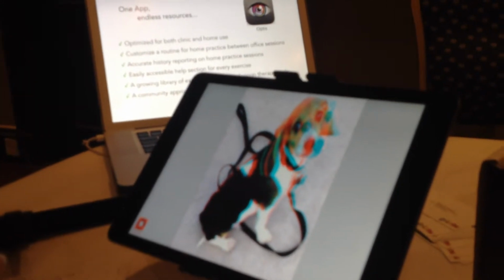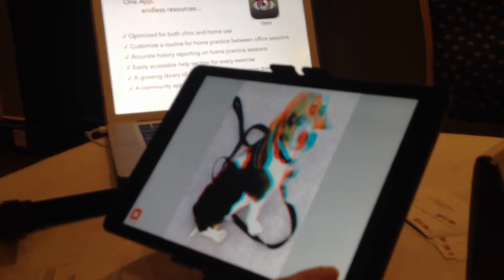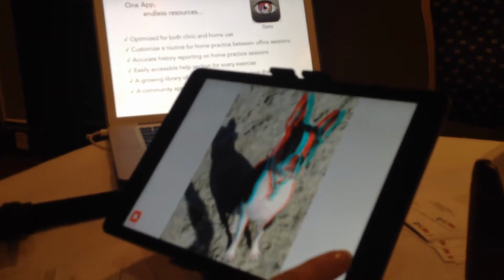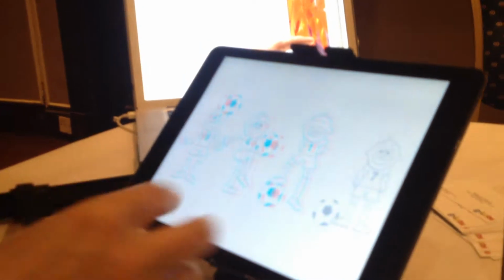And I think you told me that if there are red and cyan targets that you can get off the internet, or if you have a 3D camera, you can actually incorporate those into the therapy, correct? We're working on building that in. Okay. Something to look forward to in the future. Yes. We have some things like line drawings, contour, stereo. We have to localize where those images are near and far.